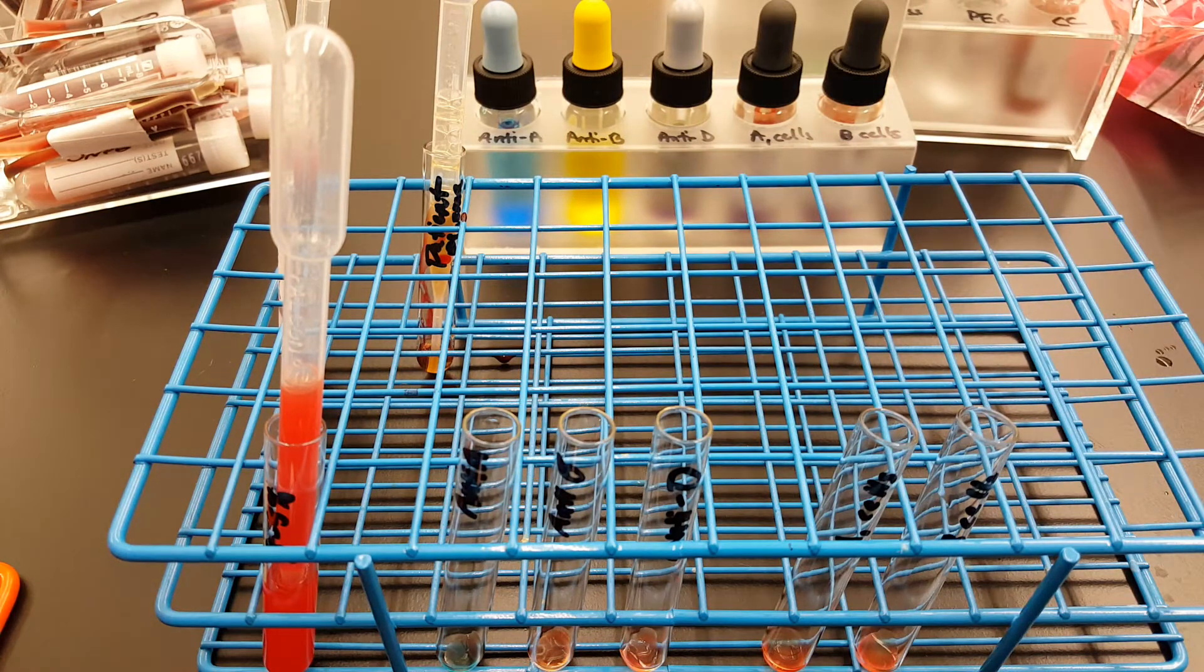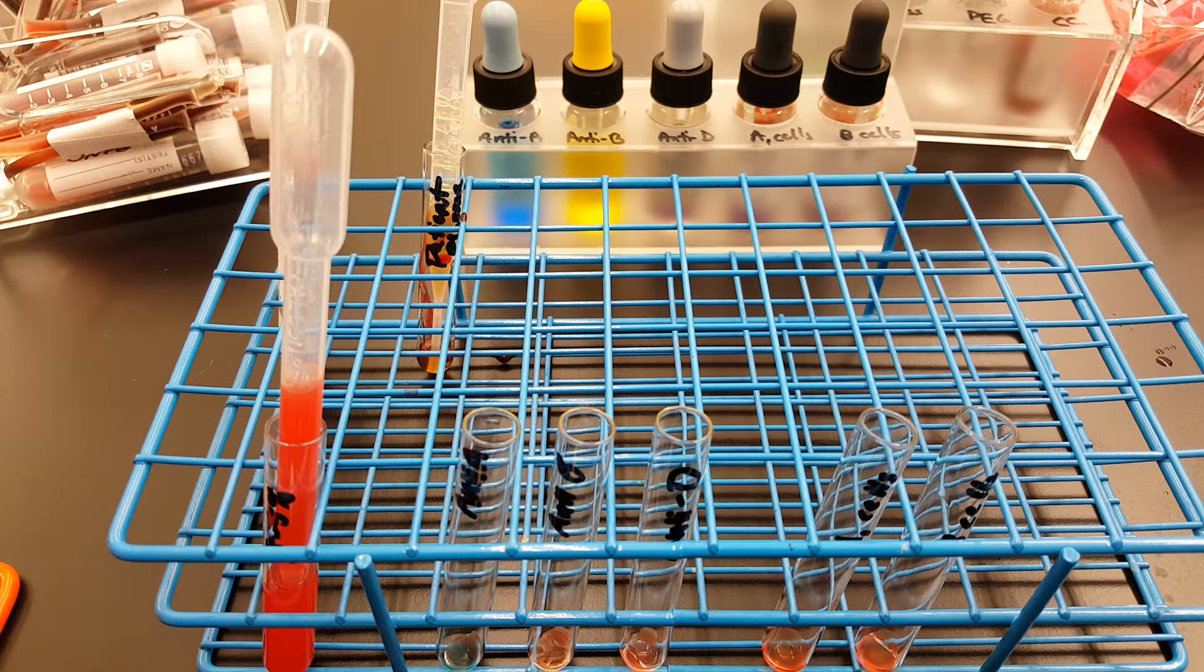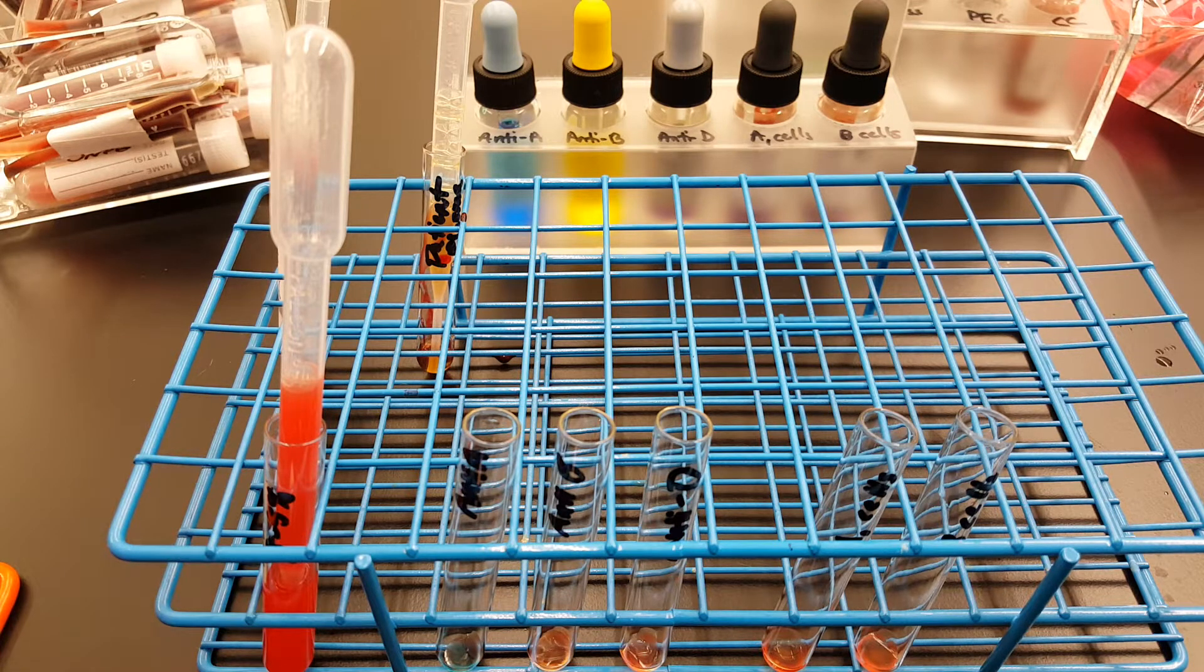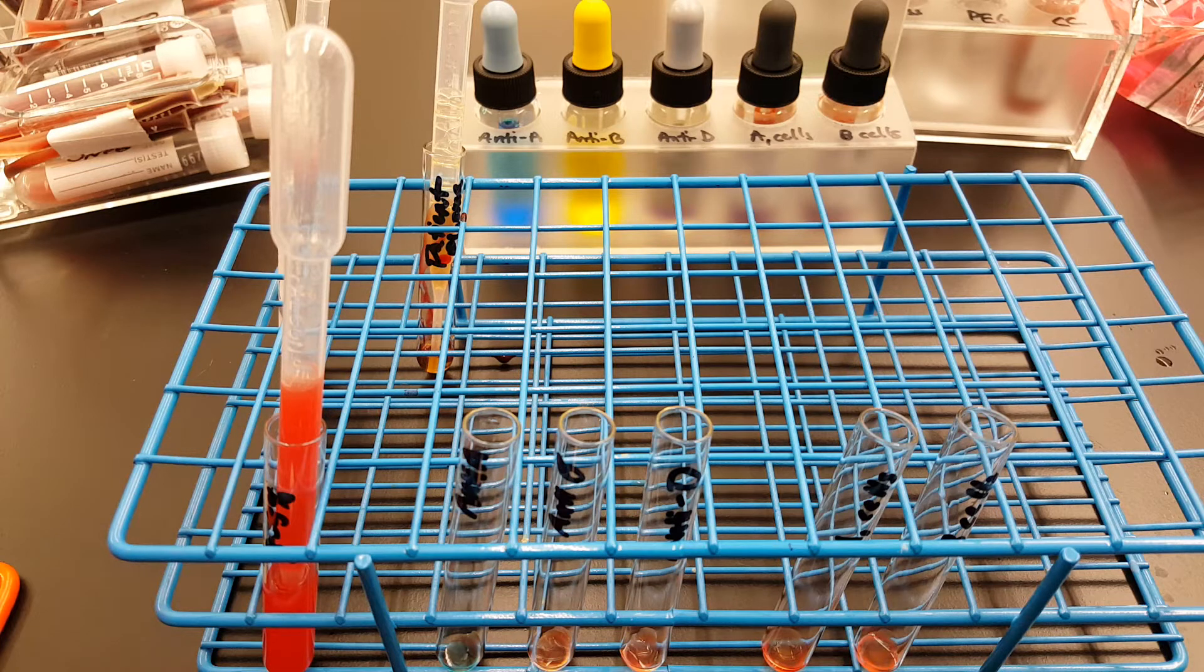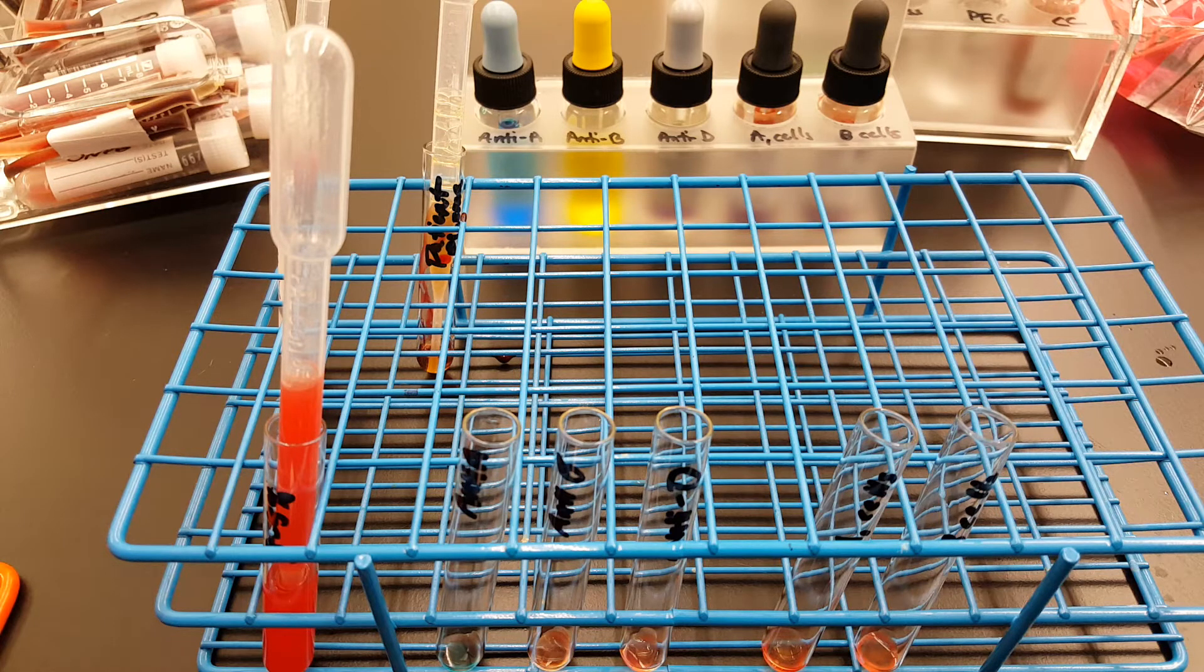And it's because we know the concentration of the elements that are in the reagents, whereas we don't know how much antibody is in the patient's plasma. So when we do this, we want to make sure that we get a nice really good reaction, so adding two drops of the patient's plasma is good instead of just one. So we're just trying to increase reactivity.